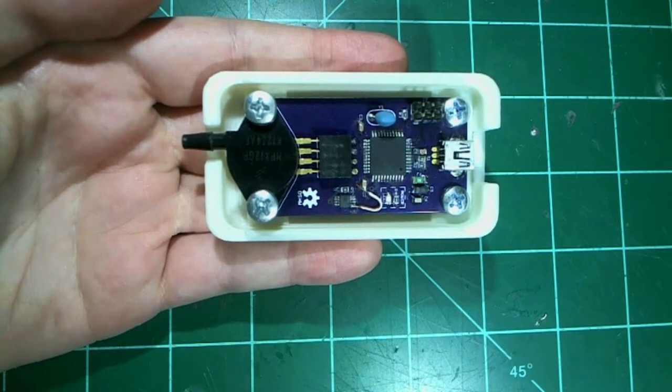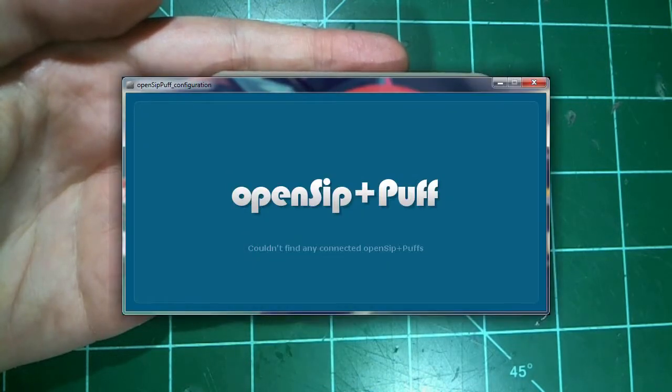Right now, I am working on a desktop configuration program that will let users reconfigure their device without ever having to see a line of code or upload sketches to the Arduino IDE. You can control the device's behavior using a simple visual GUI and have the changes automatically be updated in the device's EEPROM. So far, I've developed several rounds of prototypes and have now arrived at a design that I'm confident in. I've developed a comprehensive bill of materials and have some preliminary analysis of how much it would take to actually produce a small run of 100 boards through Seed Studio's Propagate service.